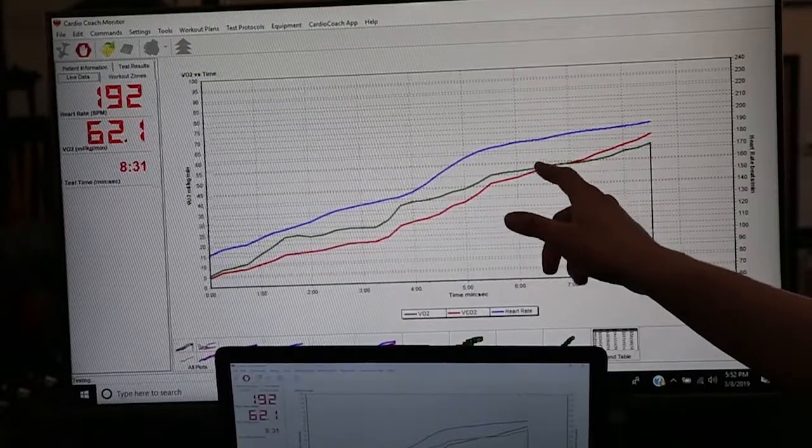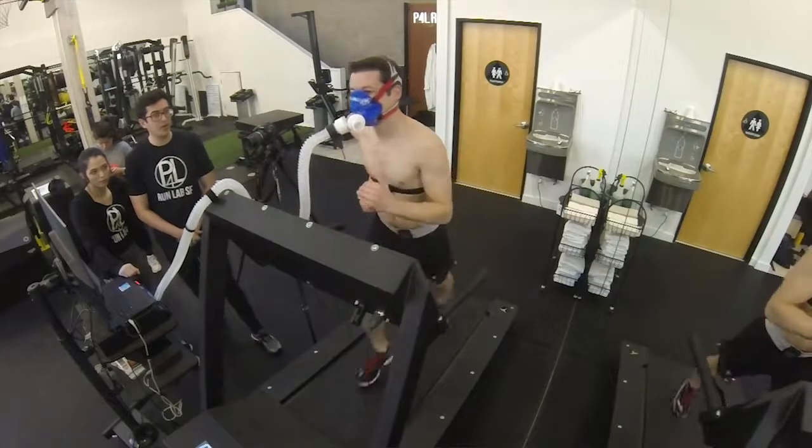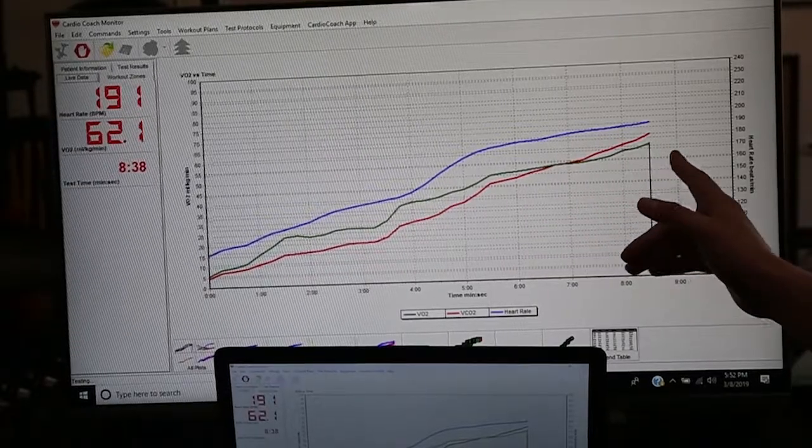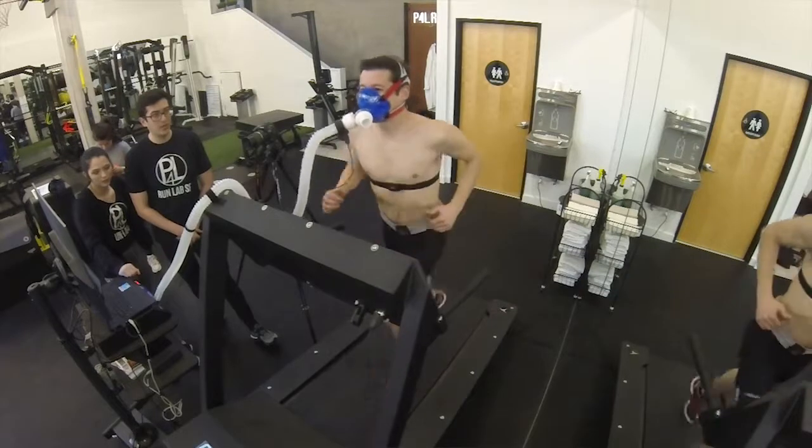At this point, your body is kind of going towards these more short-term energy systems, which is unsustainable. So I know for a fact that at some point within the next 30 seconds to a minute, he's most likely gonna stop, okay?